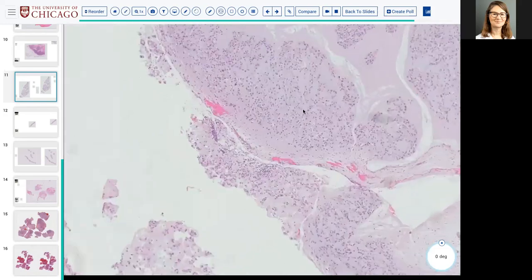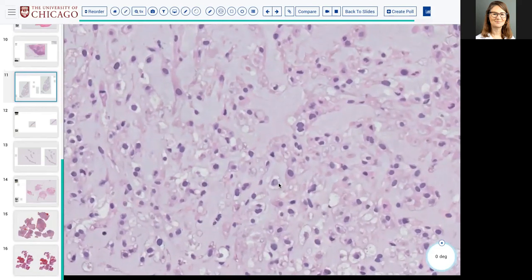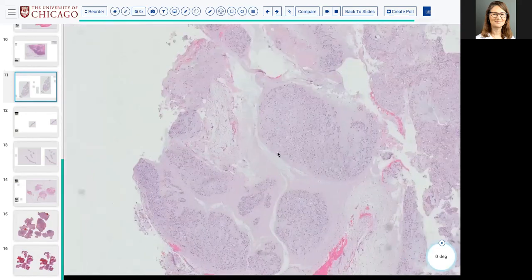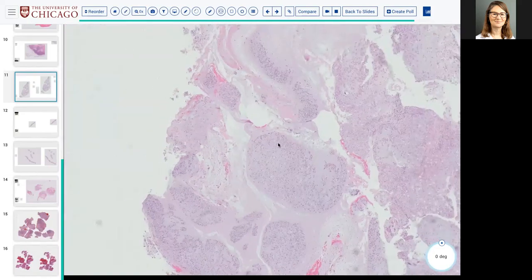So I think we talked about myxoid chondrosarcoma and how we don't really think that these are lipoblasts. I'm thinking liposarcoma. Myxoid variant of chondrosarcoma. Okay, yeah. So if you have chordoma on your differential, depending on where you are, myxoid variant of chondrosarcoma, yes, can also come into the differential.